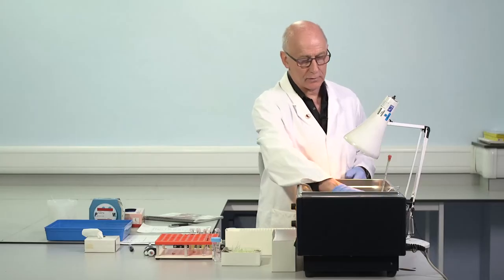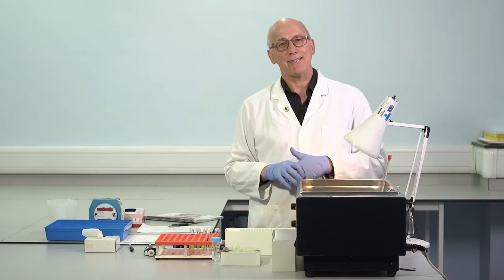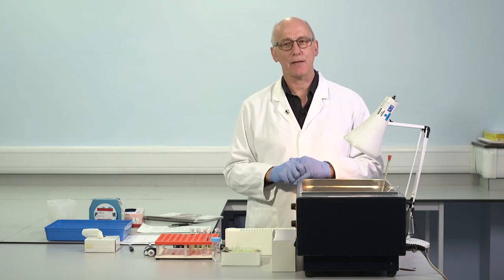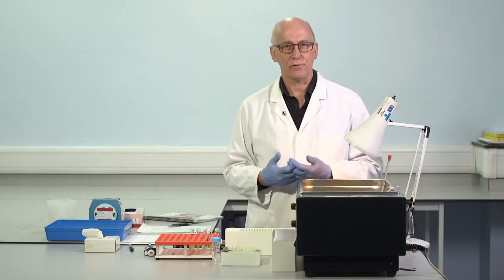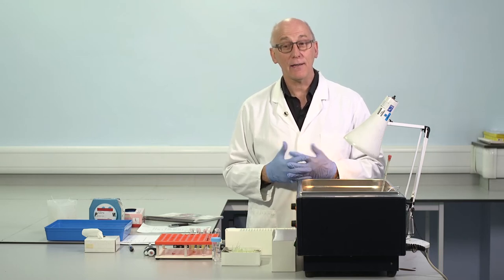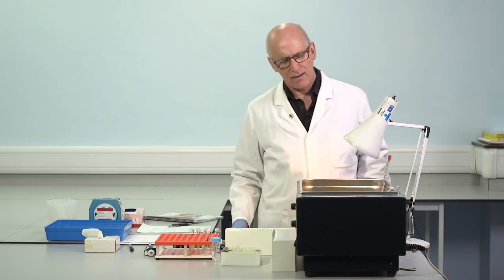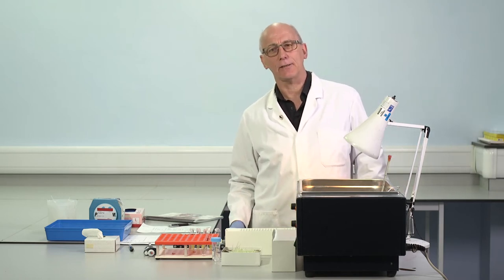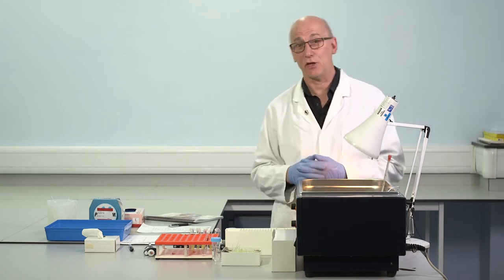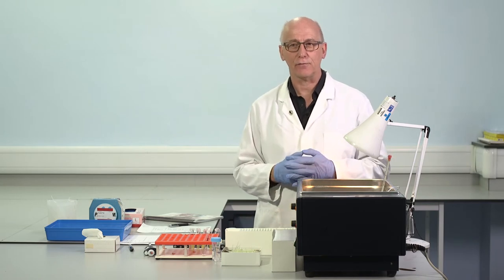So this also goes in the water bath. Whenever we're performing APTT tests, it's really important to begin with a control. We have guidelines available to us, the WFH laboratory manual we've already mentioned, but also other national and international guidelines. And a common feature in all of those guidelines in relation to APTT is that we should test at least two levels of control.